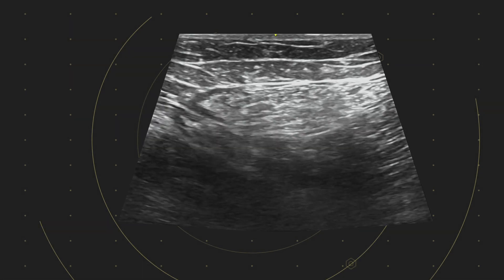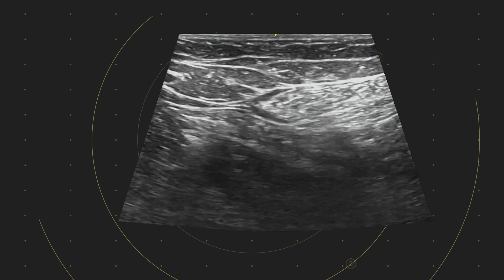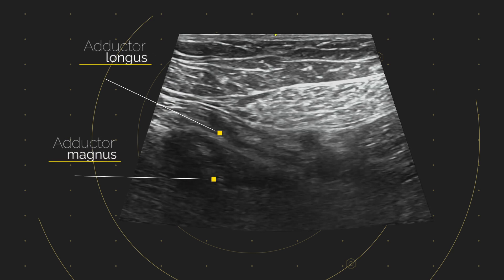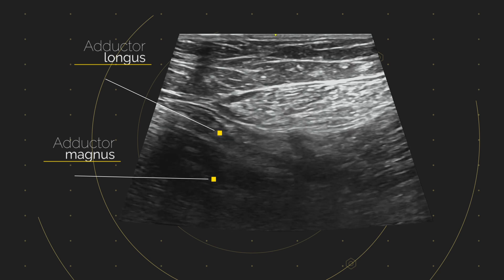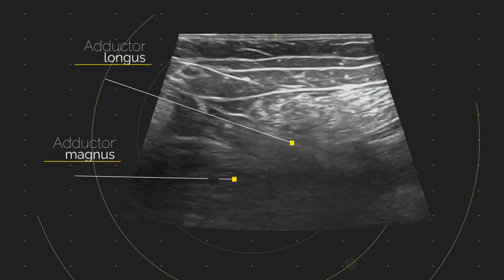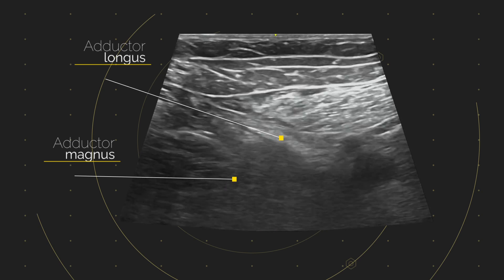We placed a probe on — we've got the luxury of virtual convex — and we're discussing finding the right location in terms of where we are on the leg. We're looking for the adductor longus muscle. We've got adductor longus here, adductor magnus there, and we're scanning up and down to see the relationship between sartorius and longus.